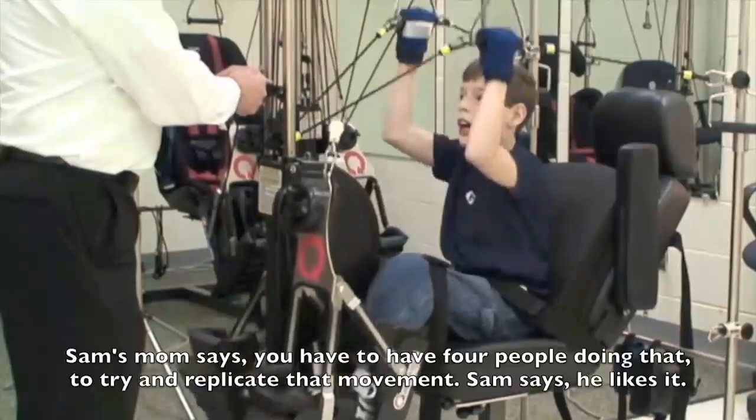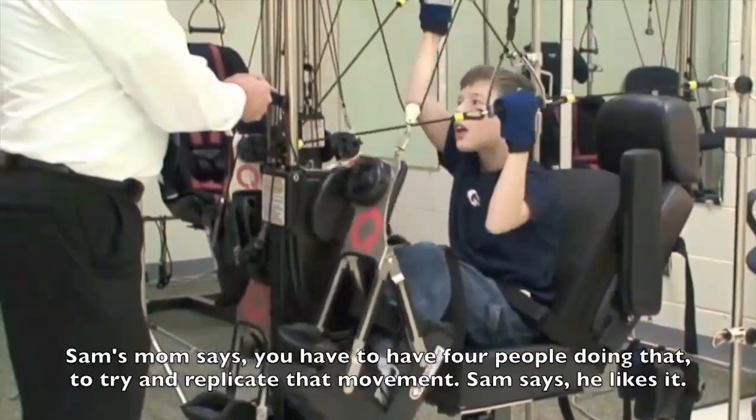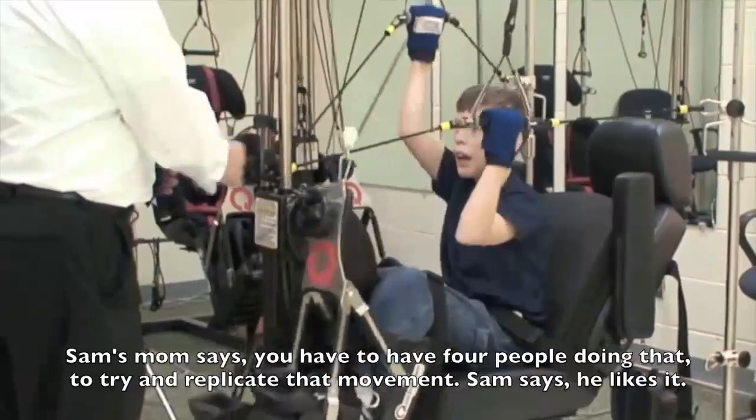The patient is responding positively to the device. You have to have four people doing that to try to replicate that movement.